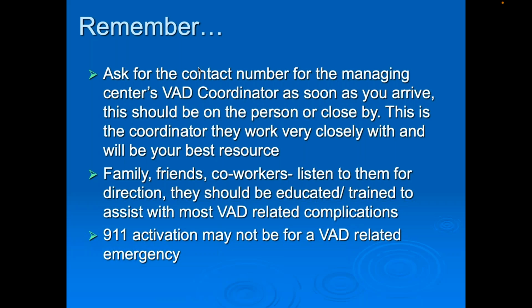Family, friends, and coworkers, listen to them for direction. They should be educated and trained to assist with most VAD-related complications. And 911 activation may not be for a VAD-related emergency. Just because they have one does not mean that's what they are calling you for.